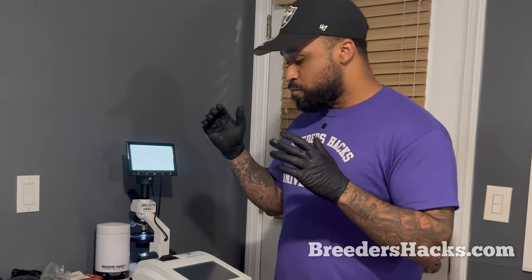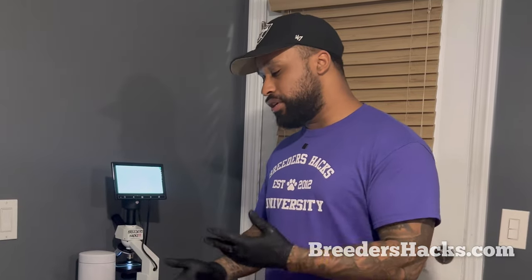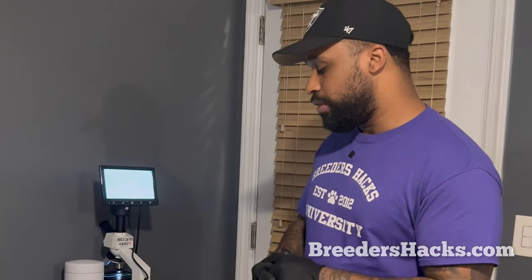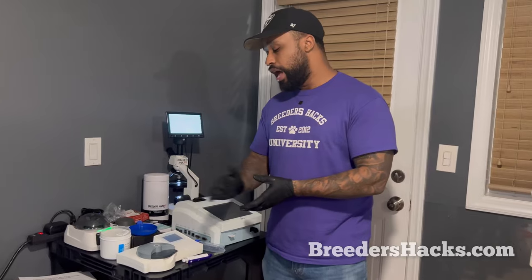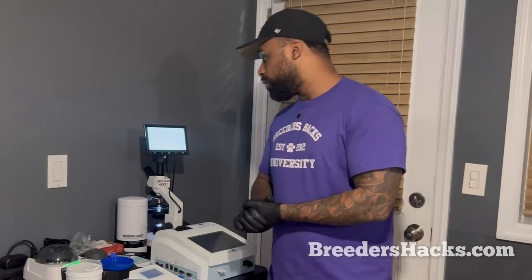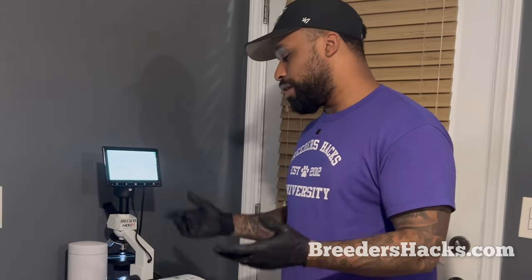This is something that, like I said, I don't know why it's not used as much in the United States. A lot of breeders aren't aware of photometers, and having that sperm count is phenomenal. It's a game changer. That's really the best way to put it. I love it. I use one now moving forward, especially with our microscope to be able to evaluate the semen. I mean, no one is getting past you.